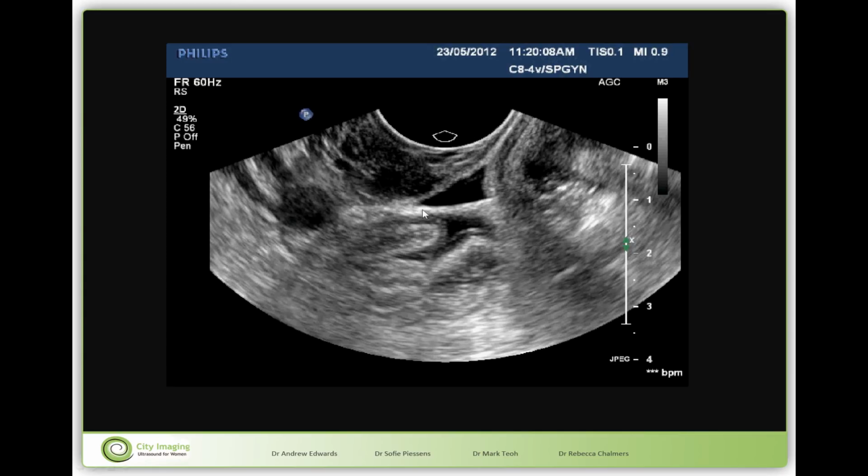On the other hand, nodules on the sacrouterine ligaments are very hypoechoic, as usually endometriosis is, and therefore hypoechoic nodules in the area of the sacrouterine ligament can be seen even when there is no fluid in the pouch of Douglas, but that is a subject of a later tutorial where we look at more subtle findings in the pouch.